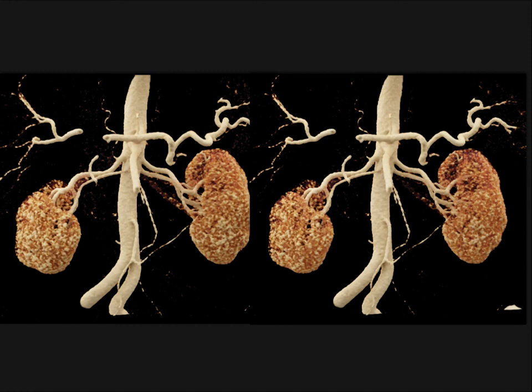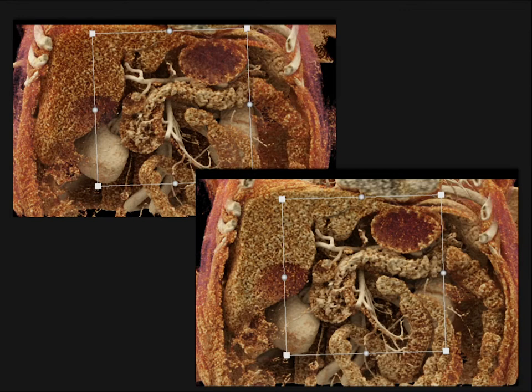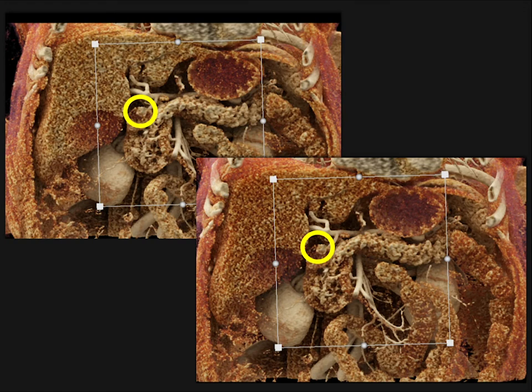Now, if I take that same data set and do cinematic rendering, this shows you very nicely the celiac and SMA, the renal arteries. And then I'll look a little bit more carefully, and now I see all the vessels. Now the lesion is not bright enough for me to see here, but if I put back the soft tissues, you can see on these images that 1 centimeter lesion. It sits right next to the GDA. And I've noticed that for whatever reason, the duodenum is very close to the GDA in many cases. And here's one more example showing you that same patient, and I'll circle the lesion for you.